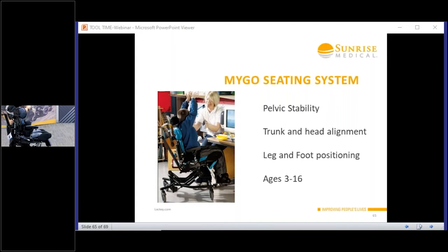I'll just lift it up and then we can show you the laterals. So these particular ones have got the complex laterals on. They're really nice, almost biangular in that sense, so they give you that little bit more adjustment. So what you're getting is that wraparound environment. So you can literally give that wrap a little bit more. Just do that so that you actually see them. So you can see that actual wrap. So the end of the lateral moves. So you can give that almost hug around the front, or you can change that body position.